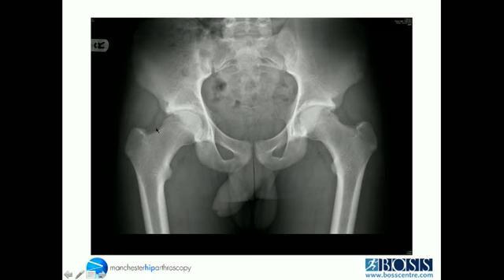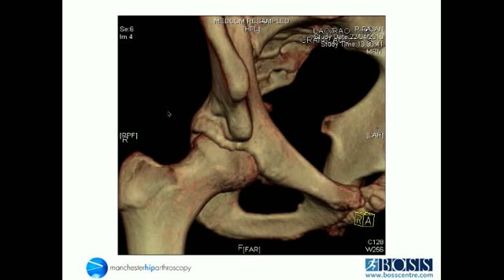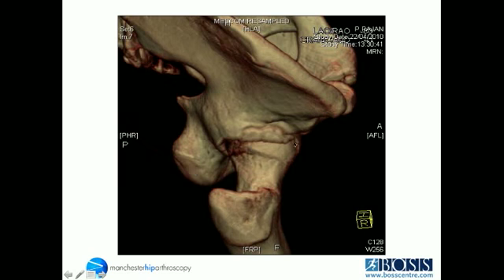And we'll also sometimes see patients with very abnormal rims. So this was a young man in his late teens with very painful hips bilaterally. X-rays looked a little abnormal, but not obvious. But once you saw his CT scans, it was clear that his soft cartilage rim had actually ossified and turned into bone, and that's why he was so symptomatic. He didn't have a gross cam deformity on his femoral head. Here's the side view again.